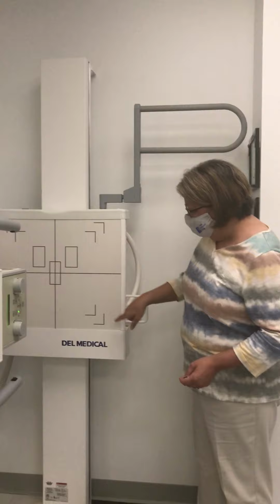Now, before I position him or do anything else, I'm going to get my tube in detent. So, I'm in transverse detent now. I know that because I see the light next to the orange button. So I'm centered to my image receptor. I'm going to angle my tube so that the central ray is directed horizontal. And it's that horizontal beam, remember, that allows us to demonstrate the air fluid level.